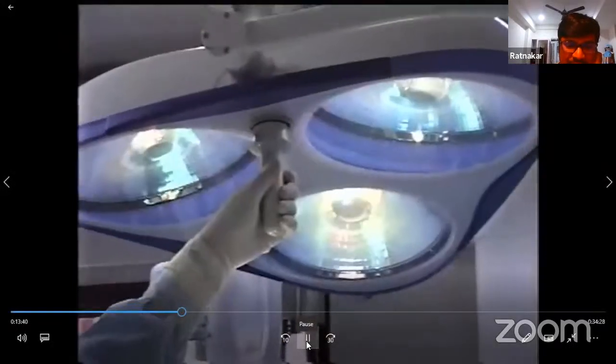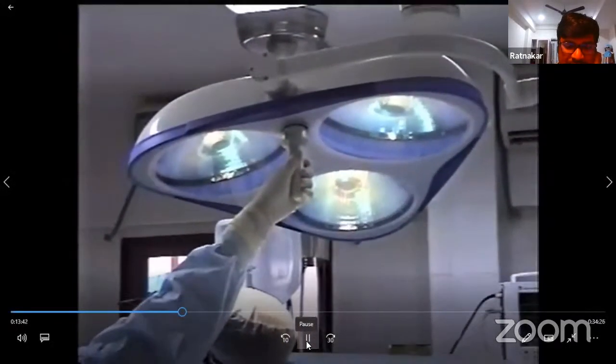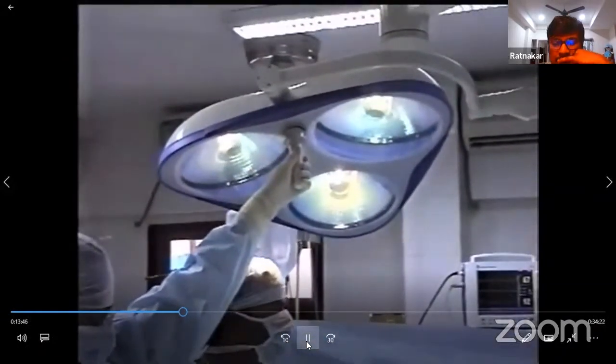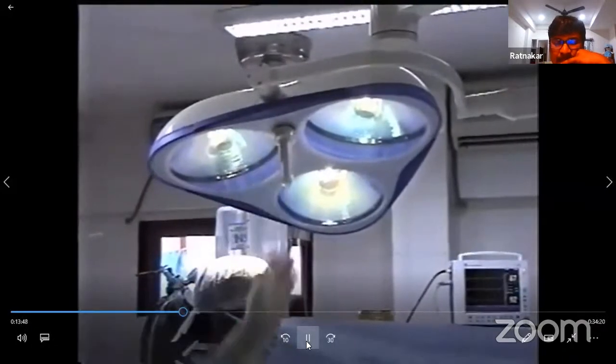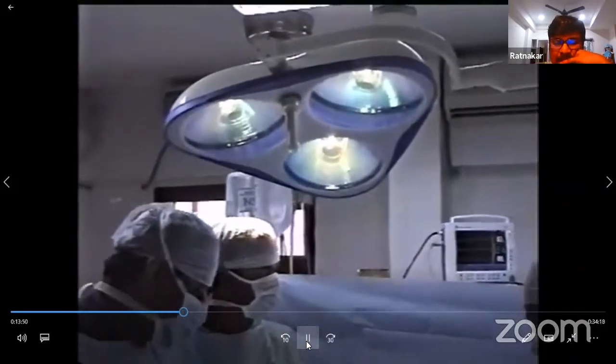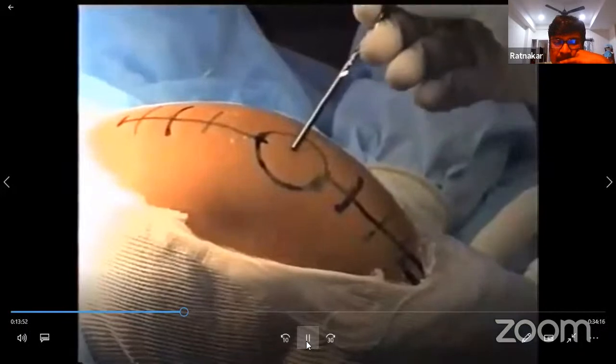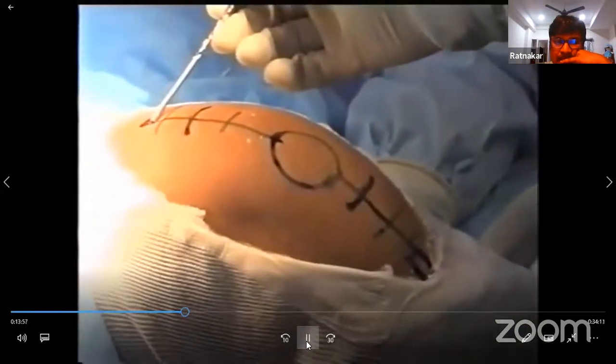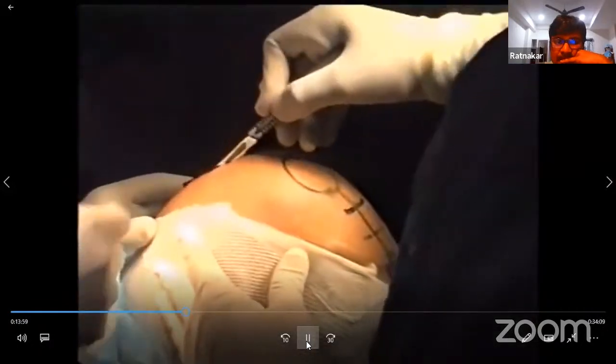Okay. So once the patient is draped and positioned, some markings will be done, and then we'll start with the skin incision. Ready to go into the surgery. That is the exposure part, which can accommodate a sterile handle, so that you can adjust the lines. These are all very minor points, but these will go a long way in making your operation a very successful one. That is the patella, that is the tibial tuberosity. And that is the top end of the incision.